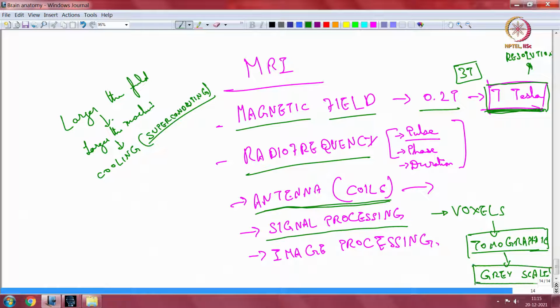Most of imaging has been very gray in color. X-rays had only 2 colors and the gray in between, and CT, being a follower of X-ray, also had gray. So MR also has the tradition of being gray. You have a gray scale in which the tomographic information is represented, from the signals acquired from the radio frequency antenna.